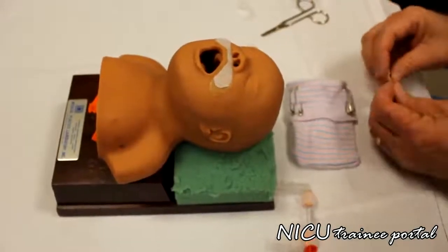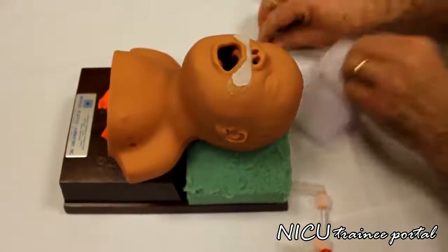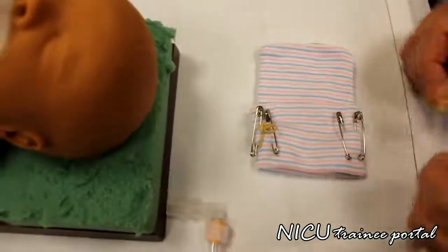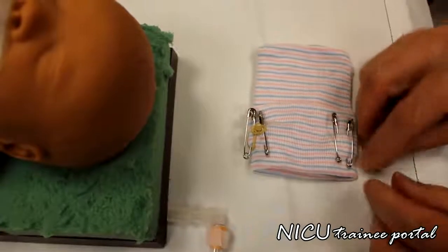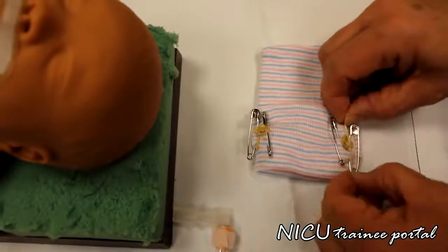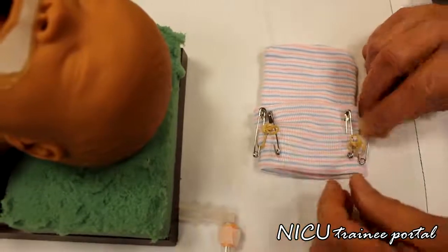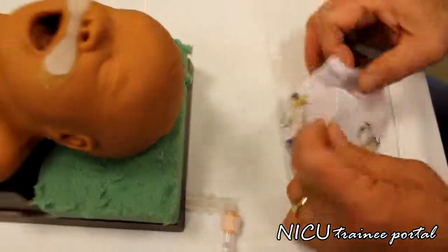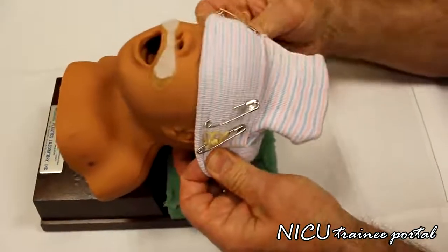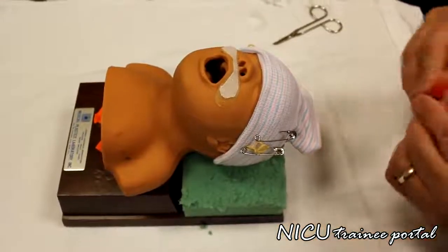But I find it easy to put the rubber bands on first before I put it on the baby. So you just loop it around the bottom. So that's sort of how it looks. Okay? So then we place the hat on, and you want to center it on the head, and then the prongs will go in.